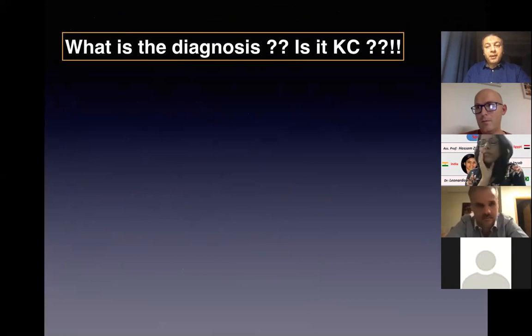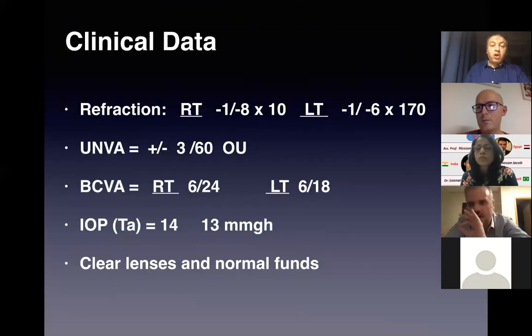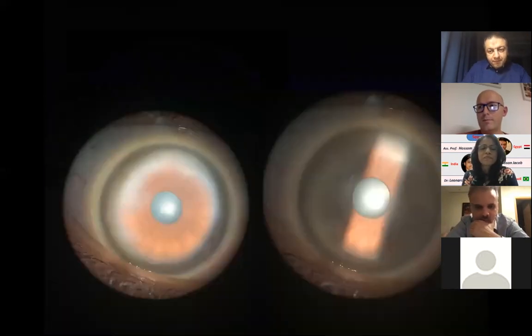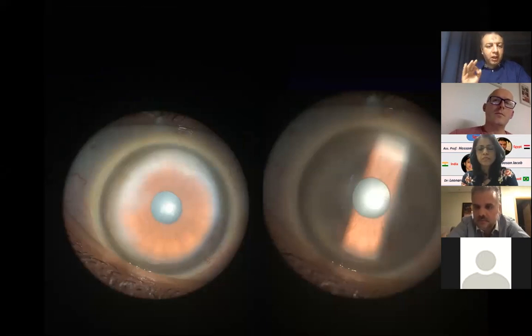Her ocular surface is completely normal. Is her ocular surface normal? Yes. On slit lamp examination, there is no scar, no haziness. I don't have a video for that, but about the images, can you find anything in this image? If you look at the superior part, just beside the slit line of the lamp, you will find a whitish shadow going to the center. So maybe there is a very faint opacity extending in the center, which makes her Pentacam steep like that.